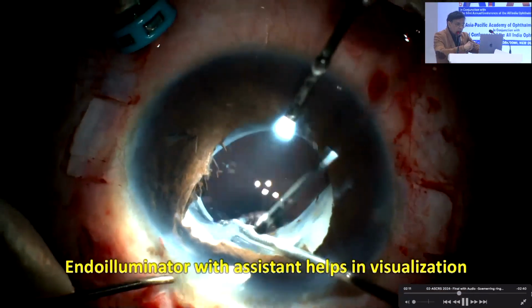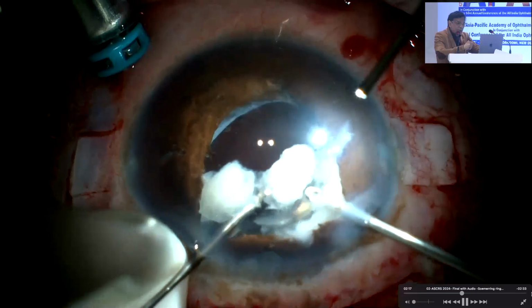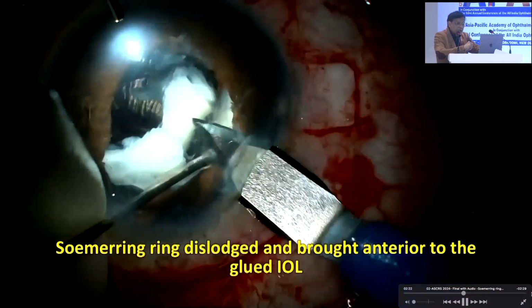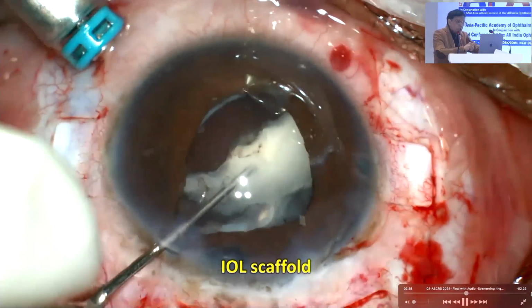So here you can see, once I have done that, I'm now trying to bring the Sommering ring in front of the IOL. Once they are in front of the IOL, you see my life will become much easier because I can now go in with the phaco probe and emulsify them. So this is the way I would suggest to manage Sommering rings.